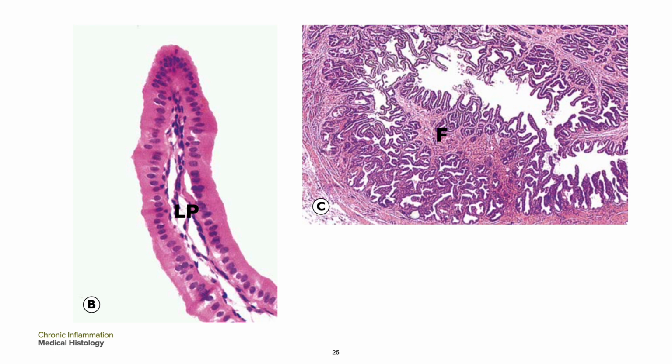In letter C, it illustrates the wall of your cystic duct which is formed into a twisted mucosa-covered fold in letter F known as the spiral valve of Heister. The flow of bile and pancreatic juice into the duodenum is controlled by the complex arrangement of smooth muscle known as the sphincter of Oddi.